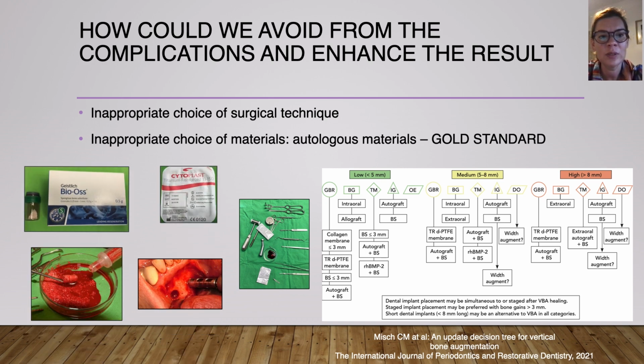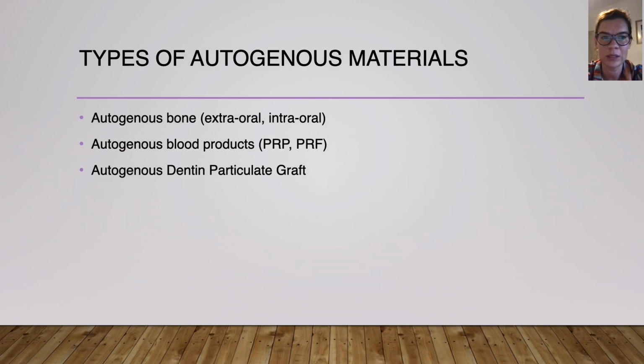So it is very important what kind of bone substitutes will be used, what kind of membranes will be used, the resorption time of the membranes, and also it is very important to fix the membranes correctly with pins or with screws. So the technique is also very important.